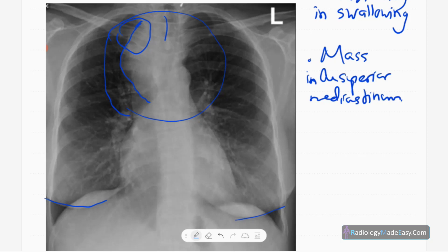The trachea has been deviated to the left side. There are no obvious bony abnormalities, and the lung parenchyma appears normal with no masses, nodules, or reticulonodular opacities. No obvious bone destruction, no pleural effusions, no pneumothorax, and no cardiomegaly. The diaphragm contours are at normal positions.